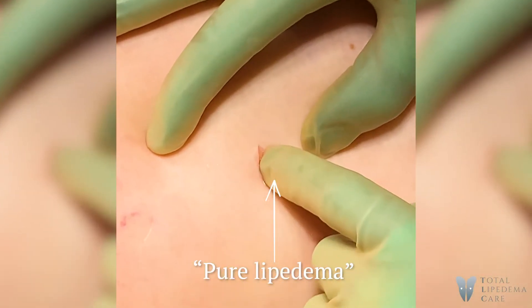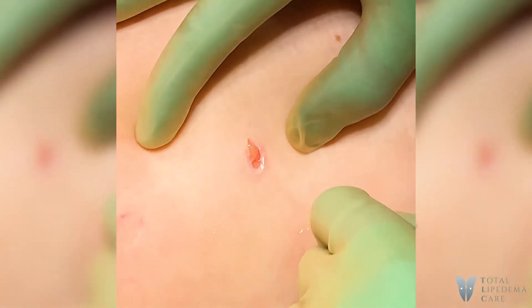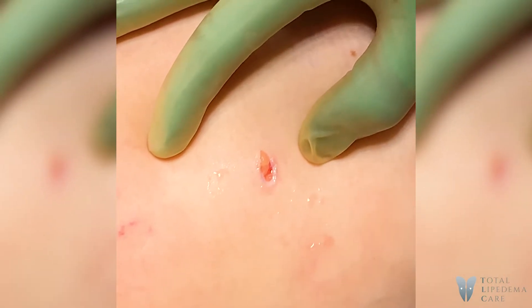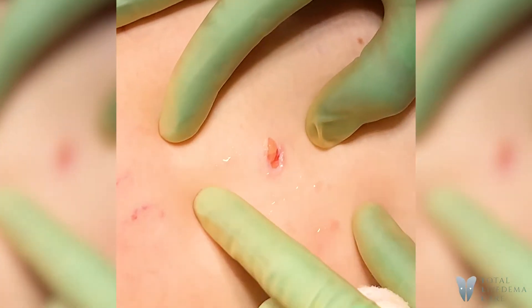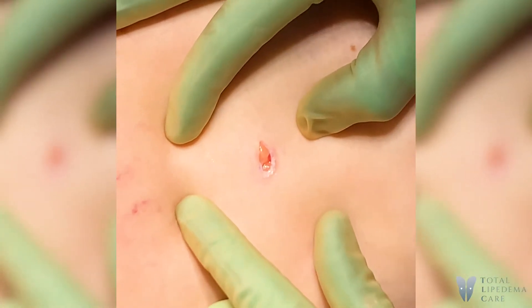Look — that's all pure lipedema just at the top, and if you can see her leg, it goes all the way down. We're going to remove all of this. The top stuff we're going to remove with liposuction. The bottom thicker nodules we're going to get with the manual and get everything out for her today. It's amazing — that's right at the skin surface as soon as you open.